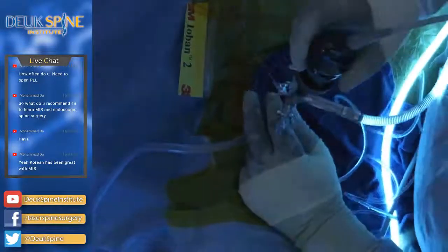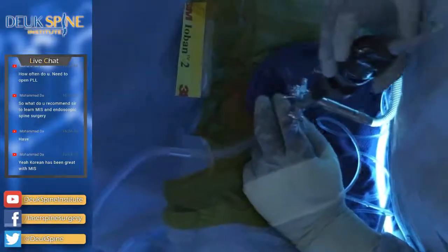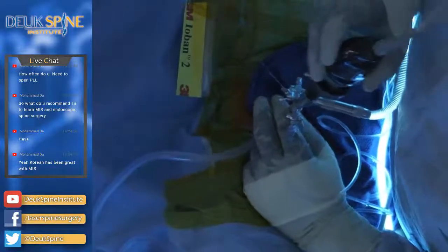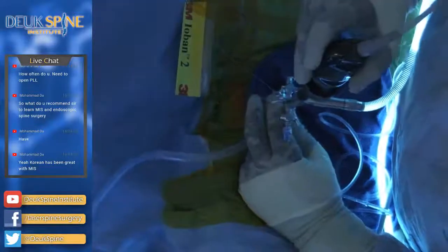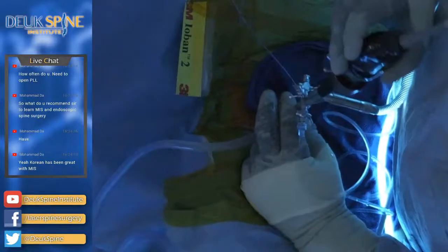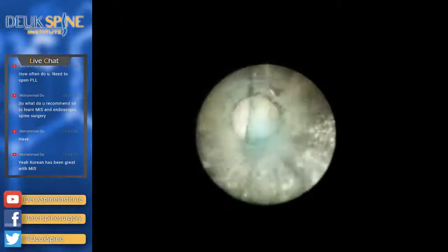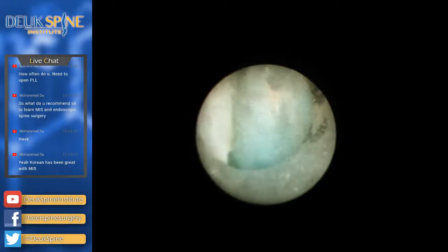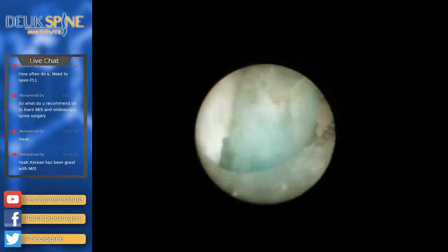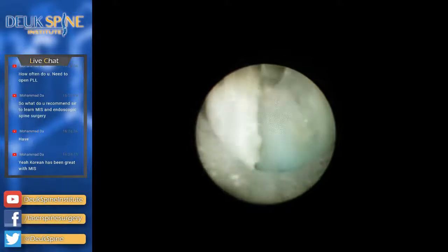So what I can tell you with this herniation is there's two components. One is a subligamentous herniation, which is this thing right here, and a bunch of the other stuff that's already been coming out. Subligamentous is the part that we already took out, and then this is the epidural component, the part that shot through the posterior longitudinal ligament into the epidural space, compressing the spinal cord. And I just want to be careful because we're literally on top of the spinal cord. So I'm going to try to blast this thing away, but I don't want to get carried away and have a problem for him.